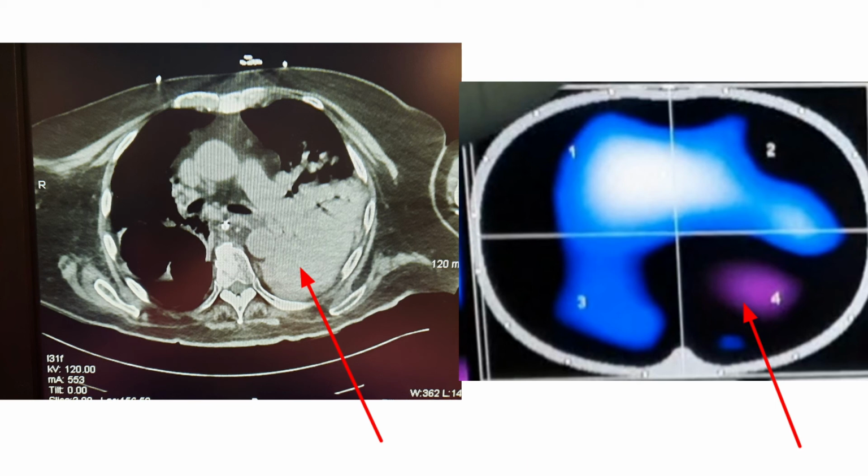This purple area appearing in the level 4 region, which correlates very well with the CT scan, shows that there's a significant amount of fluid buildup there due to the pneumonia. Looking at the radiologist's interpretation, there's also a certain amount of effusion there.